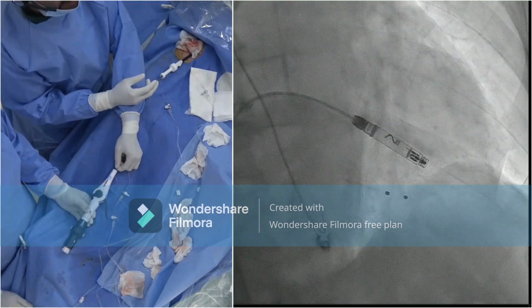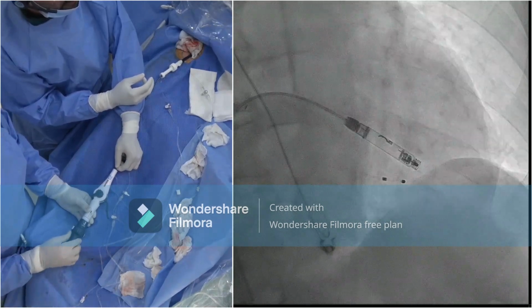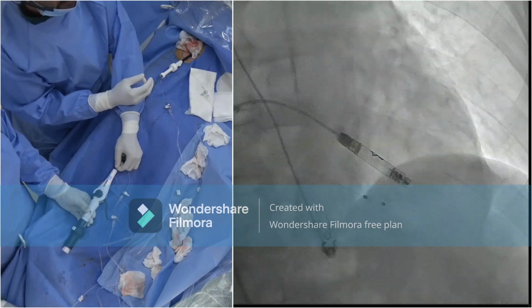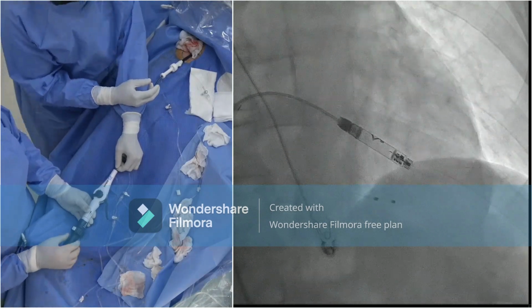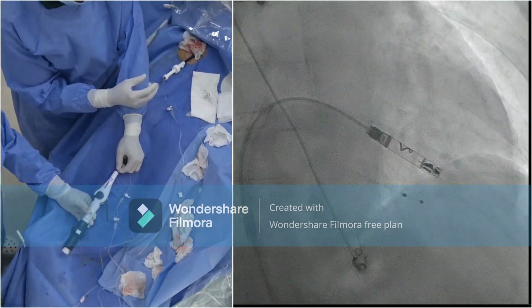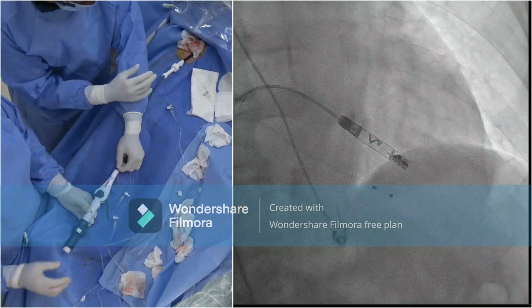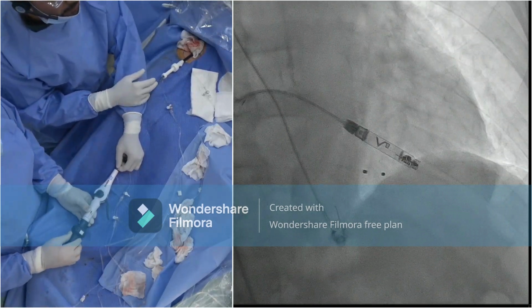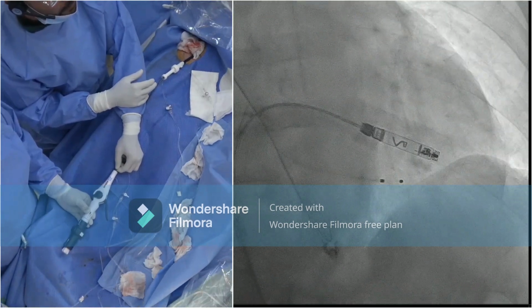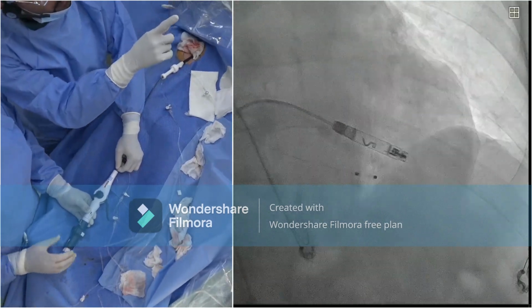Again, it moves nicely upwards, as you can see. Again, moved. Excellent. This is half a turn. One more turn to go. You see his hands very carefully. He's doing it, of course, elegantly as usual. We stop at 1 turn, but we have not reached it yet. This is our fixed. Almost.